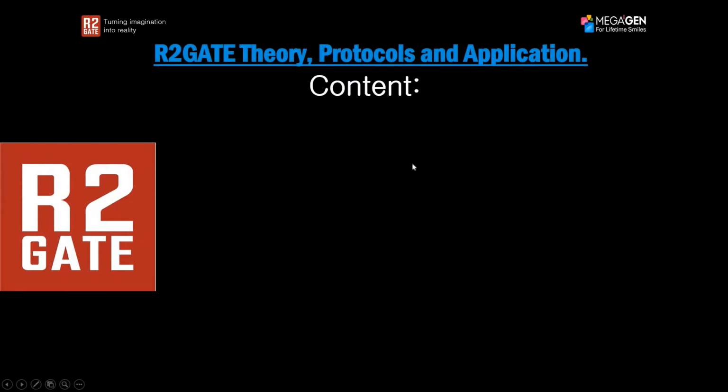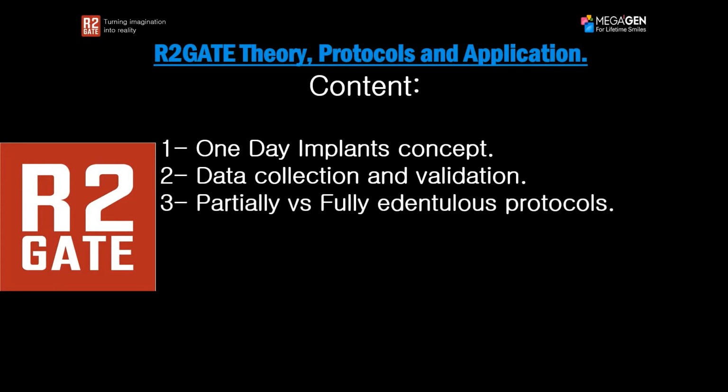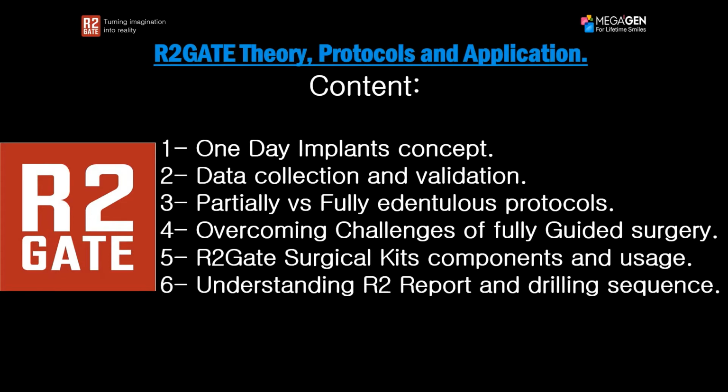So for our topic today, the content is going to be as follows. I'm going to cover a few topics, and hopefully we'll make sure that we cover all the questions that you guys have previously sent me. So the first thing we'll cover is the one-day implants concept. And also we'll cover the data collection and validation. How do you gather the right information, and how do you confirm that this is actually the information that you really need? We'll talk about the partially versus fully edentulous protocols. We'll talk about overcoming challenges of fully guided surgery, R2GATE surgical kits components and usage, and understanding the R2 report and drilling sequence. These are the 6 topics I'm going to cover in my presentation today.